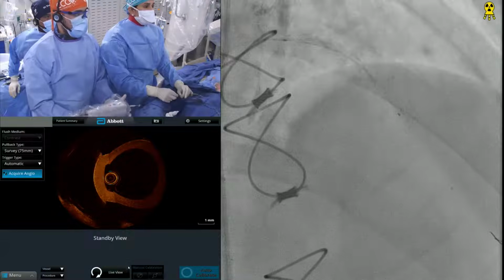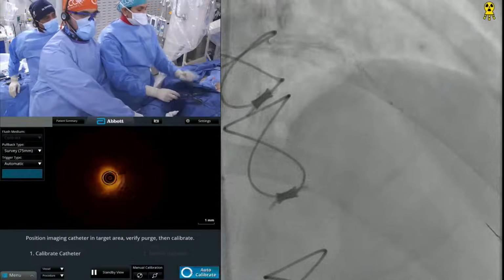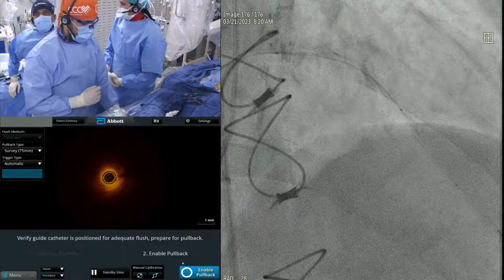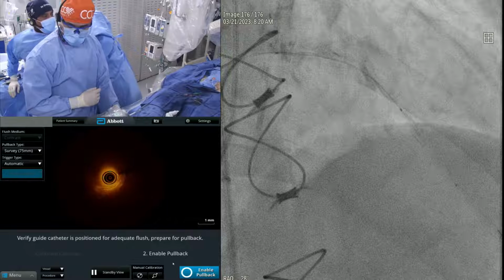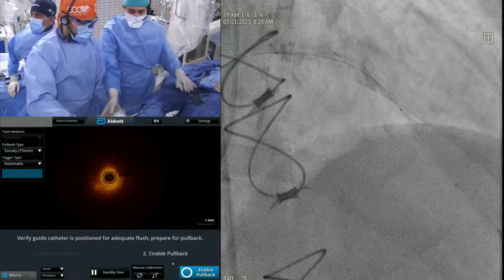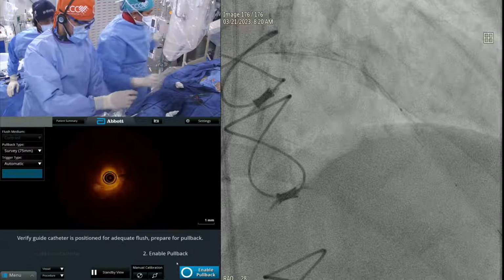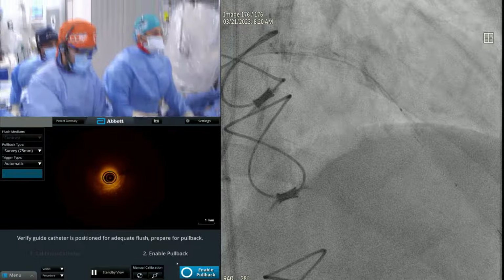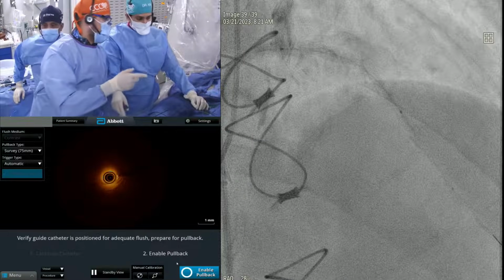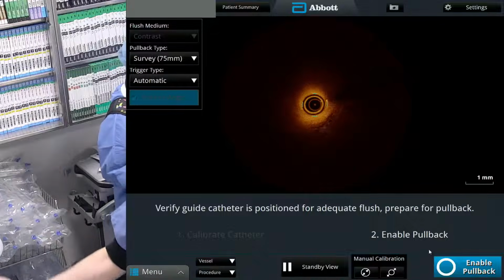We stay away from left main; distal left main we are able to visualize with OCT. Ostial we cannot. We are talking about distal left main. What is the criteria of significant distal left main on OCT? That's the question. How would you diagnose the distal left main on OCT? The criteria we know is the IVUS criteria. Is there an OCT criteria of the lumen? Because OCT always looks almost 1 millimeter lower than IVUS. And clearly, guideline-wise, OCT for ostial left main is not good. Good clearance. Okay, we are going.